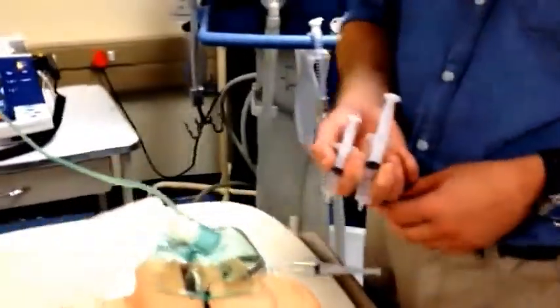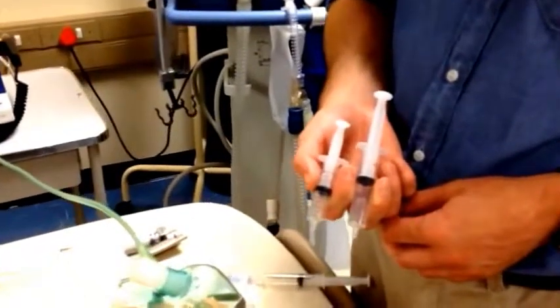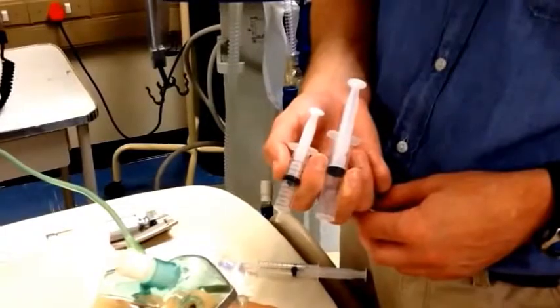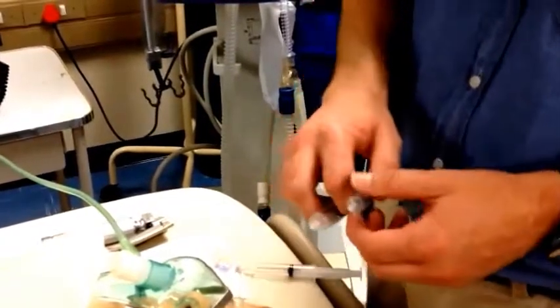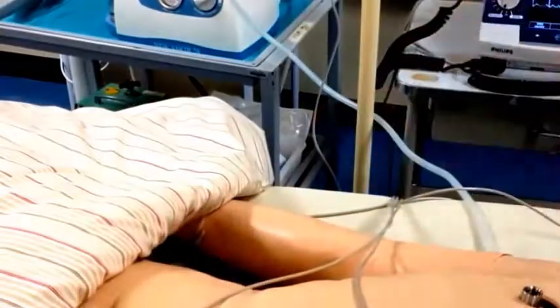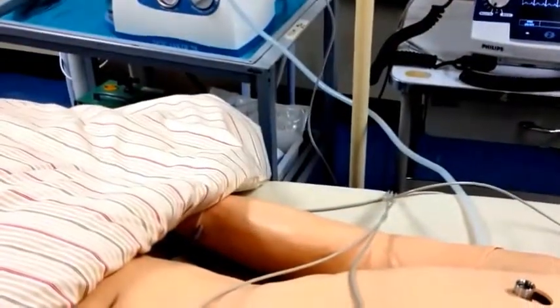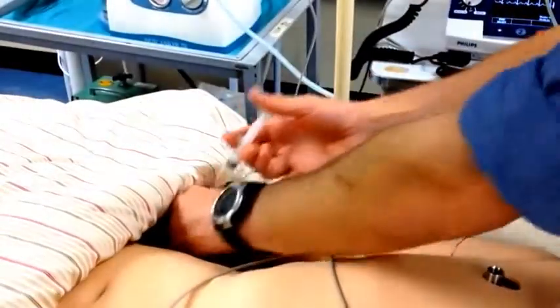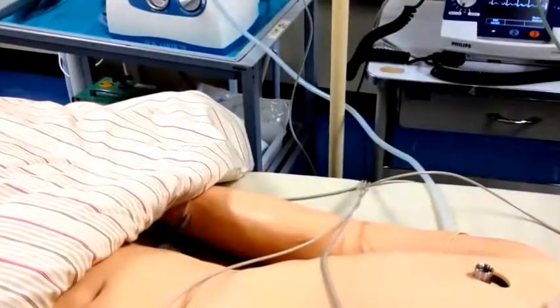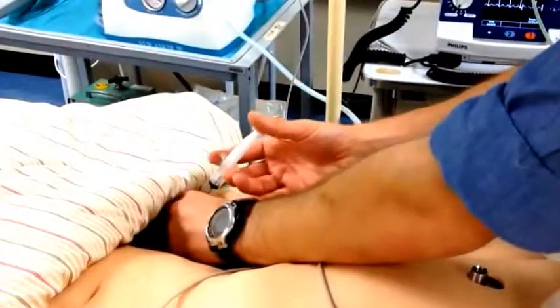Administer the induction and paralysis agent in short succession to each other. You could do this yourself or ideally ask an assistant to do this for you. Administer the induction agent. Followed by the paralyzing agent. And finally, a saline flush.